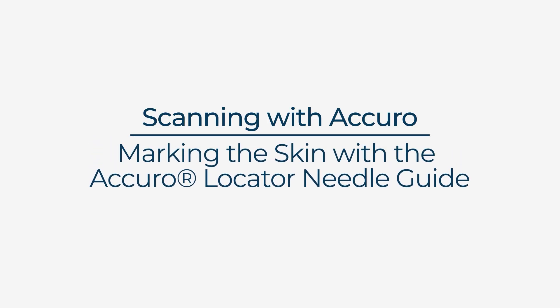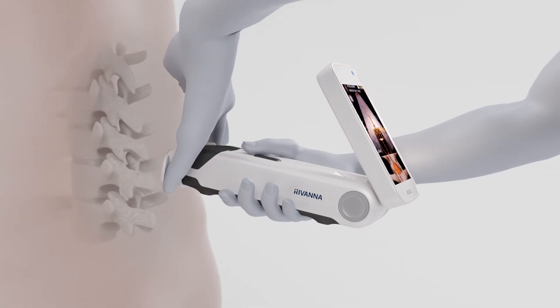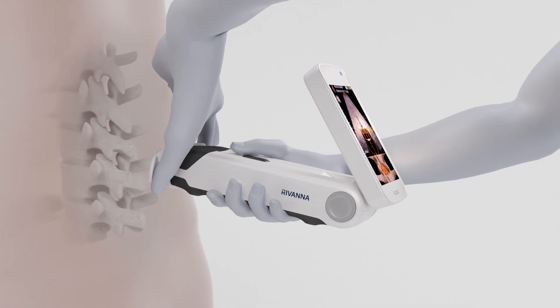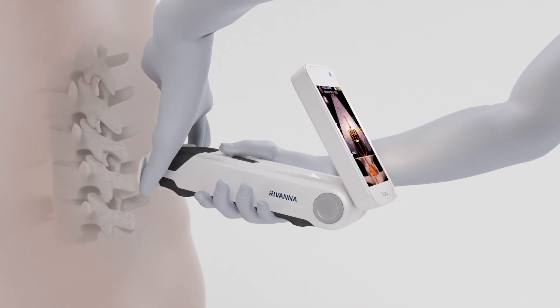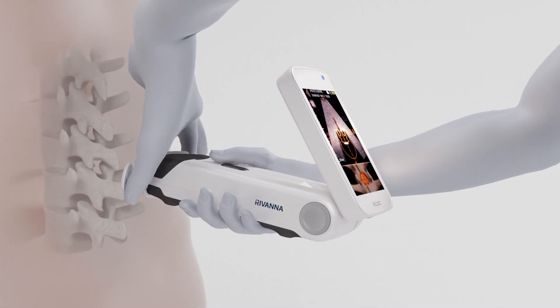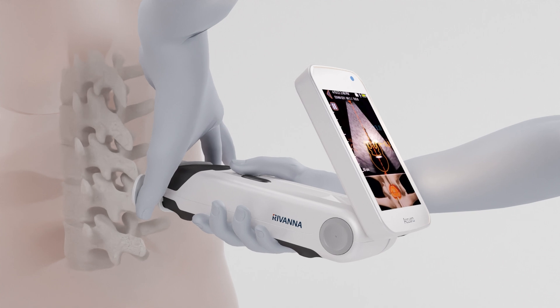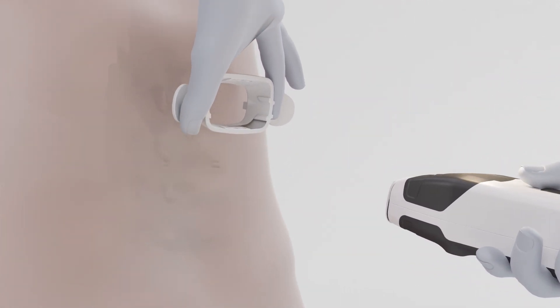Marking the skin with the Acuro locator needle guide. With your non-dominant hand thumb and index finger, grasp the locator inside the wings as close to the device as possible. For best results, stabilize your non-dominant hand against the patient's back. Keeping your non-dominant hand anchored and the locator steady, pull back on the Acuro device to release the locator.